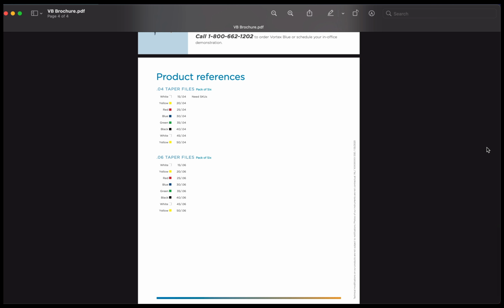Number one, you have sizes all the way from as small as 15 up to 50, which covers almost every case other than that immature central incisor that might come your way, in which case you're going to just instrument with large hand files, sometimes up to 100, 150. And you have lots of options. You can handle any case with this system.